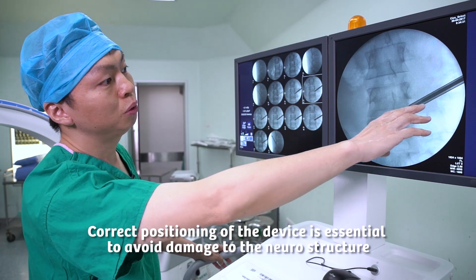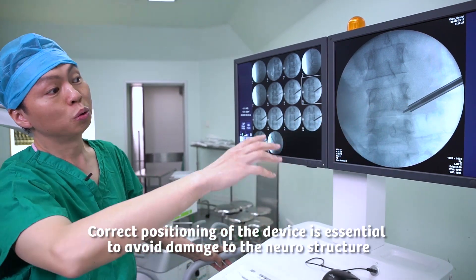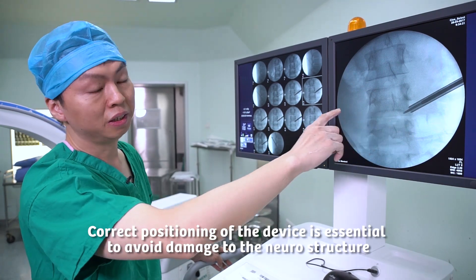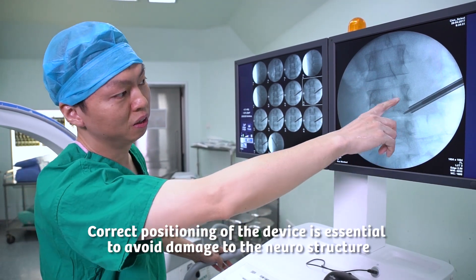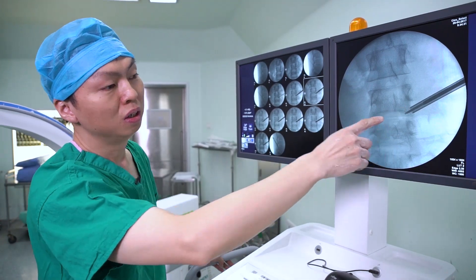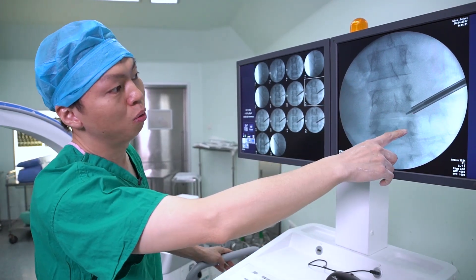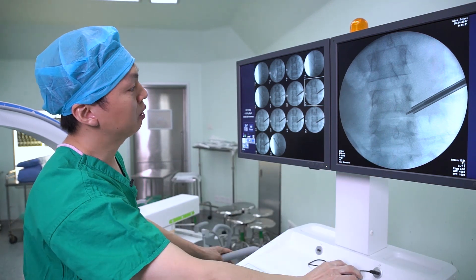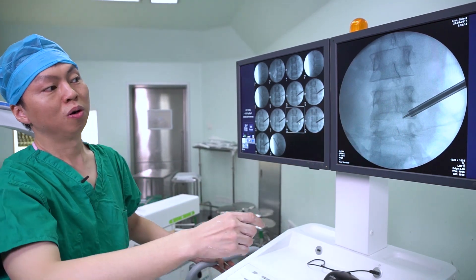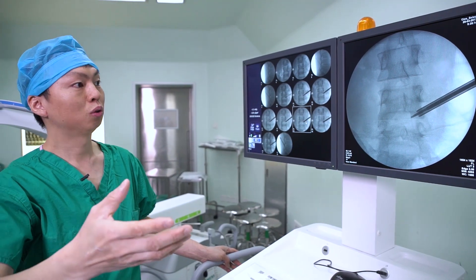The second step, we have to use a kind of saw to remove some bone, but we have to avoid damage to the neural structure. So it's very important for us to know where the tips of this saw are. If we cannot clearly see the positions of the saw, then we will damage the neural structure.